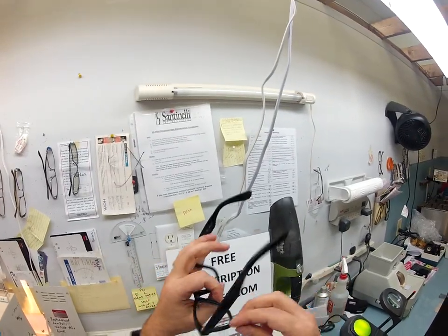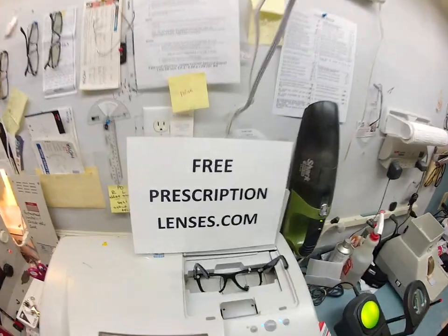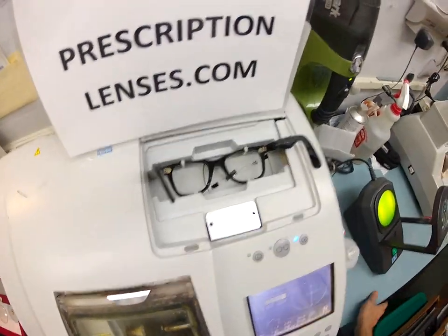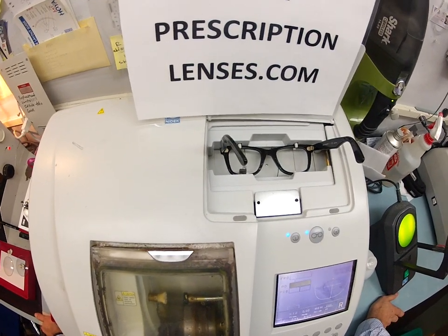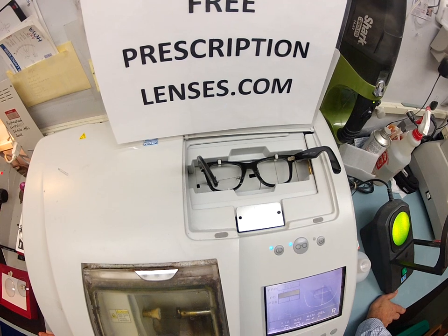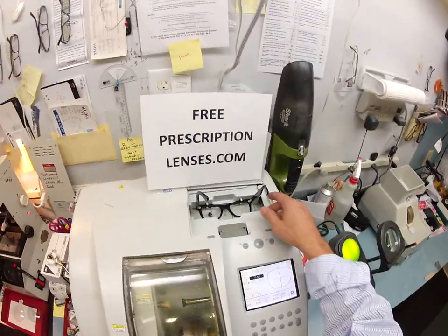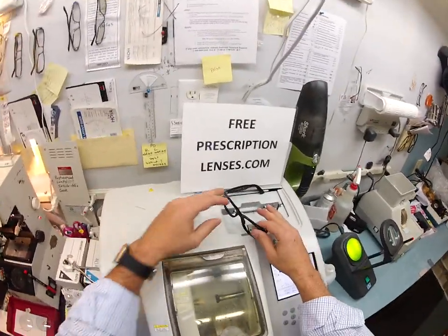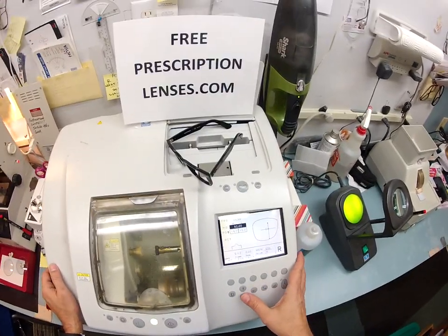The first thing I'm going to do is pop out the original demo lenses. Then I'm going to trace the shape of your frame in my Santinelli LE 1000 edger — it is now tracing the right lens, then it'll pop over and trace the left. Here at FreePrescriptionLenses.com everybody loves a bargain and no one is disappointed with quality. You're getting the unbreakable polycarbonate lenses — bulletproof up to 22 caliber — with both UVA and UVB protection.